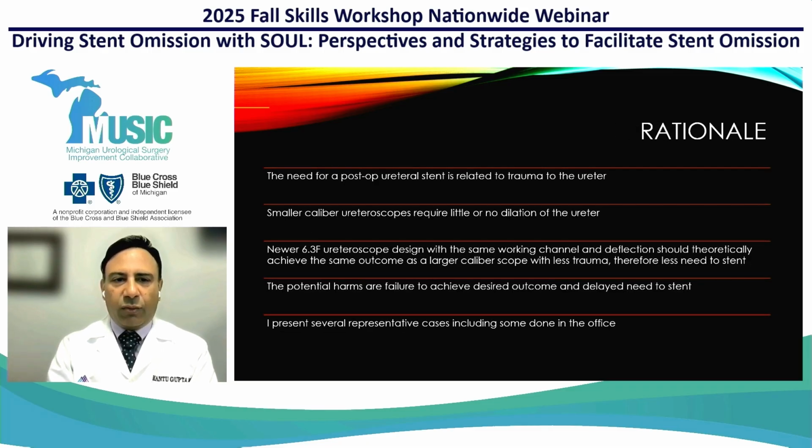The rationale for using a smaller ureteroscope to allow stentless ureteroscopy is clear. The need for a postoperative stent is related to trauma to the ureter, and a smaller caliber ureteroscope requires little or no dilation of the ureter, and theoretically there should be less trauma.